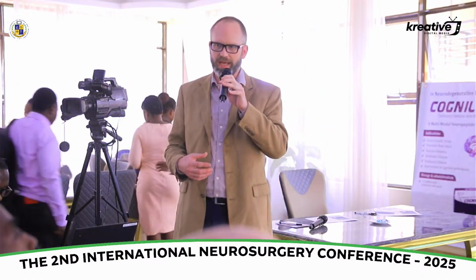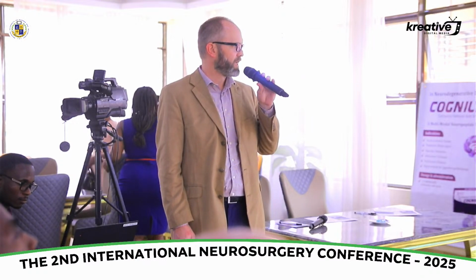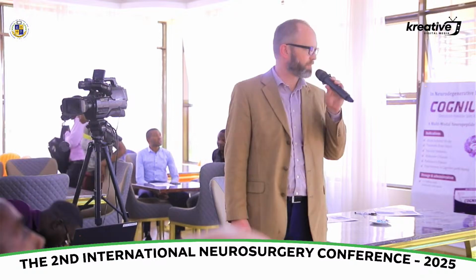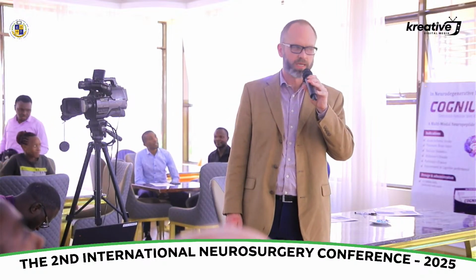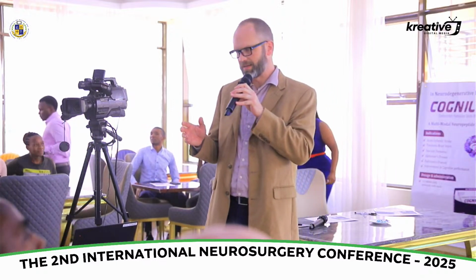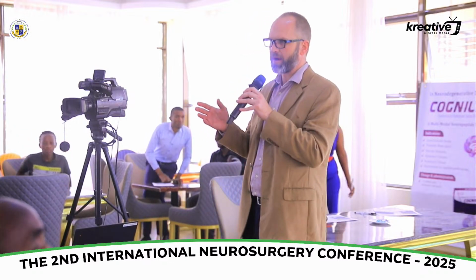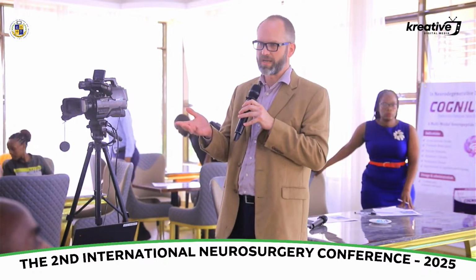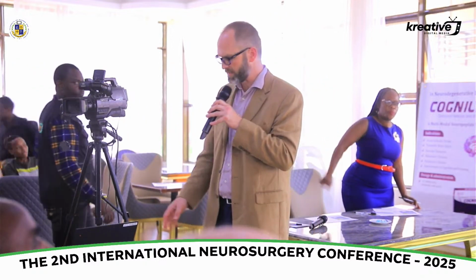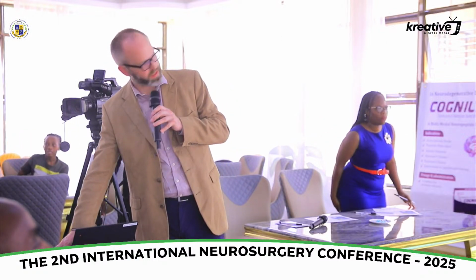So this looks at blood vessels and flow, including flow velocities. Color Doppler adds directional information to blood flow imaging, and with power Doppler, you lose directional flow information, but you can image smaller vessels. With color Doppler, you need to be parallel to the blood vessel you're trying to image to get accurate velocity information, and with power Doppler, you don't have to do this. So there are settings where it's useful to use one or the other.